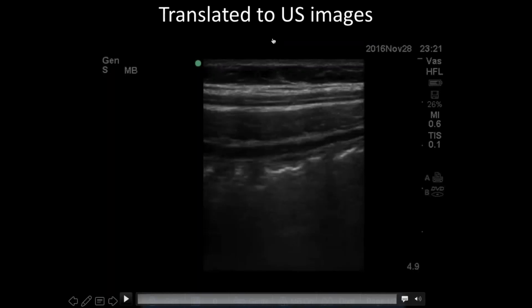All right, so moving on, this is kind of what I was talking about in terms of layers. Before I play this clip, we're just going to go through some of it. So skin, subcutaneous tissue, all of this is going to be muscle content. And then from here onwards, this line here is the peritoneal lining. Now, these hyperechoic areas that you can see, this is air in the ascending colon. This is a patient that I'm scanning down that ascending colon.